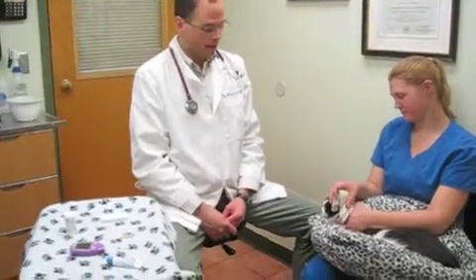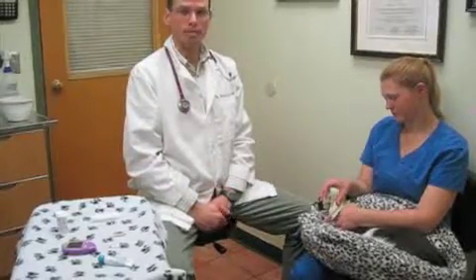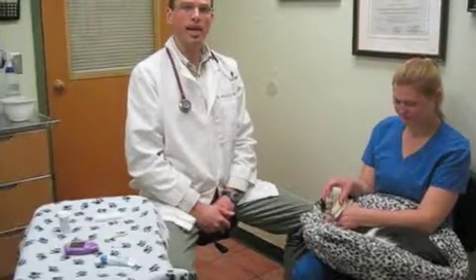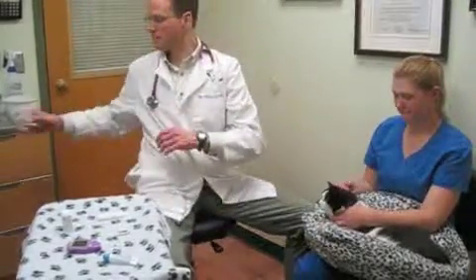So now we just need our first patient. This is Mona, our diabetic cat. We're going to go ahead and get a blood sample. My assistant already has a warm washcloth applied to the ear, which is the best place to take the sample, and that'll just help it bleed a little easier. So we can take that off — 30 seconds is plenty.